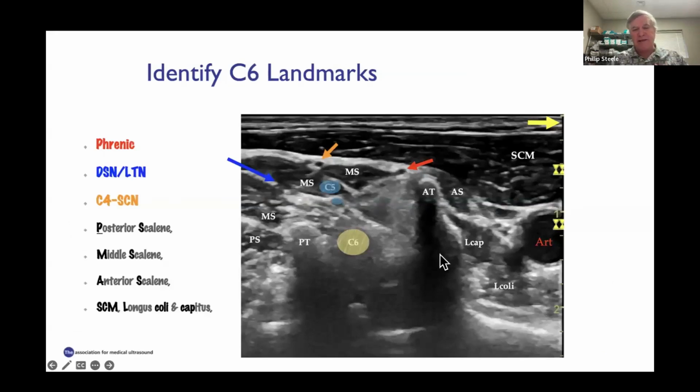So here's our classic C6 nerve root and Chassaignac tubercle. This is a fairly prominent anterior Chassaignac's tubercle. This is a wide set, deep neuroforamen, and I try to describe them. Some of them will be shallow, some of them are narrow, some of them are quite wide. The wider they are, the less likely you're going to have an entrapment. The more steep and narrow they are, the more they can create some impingement or entrapment findings.